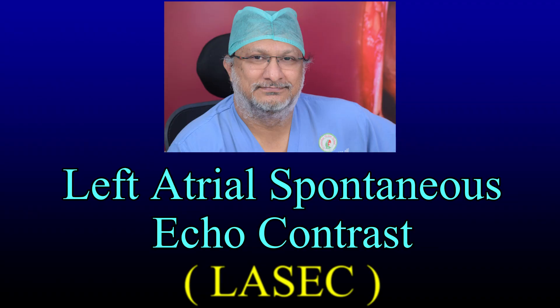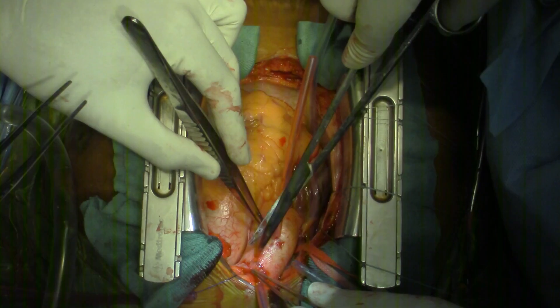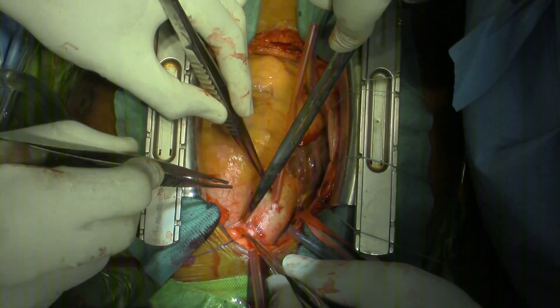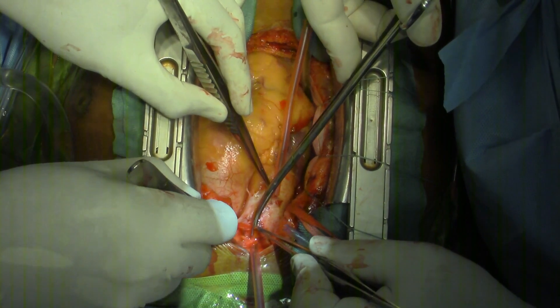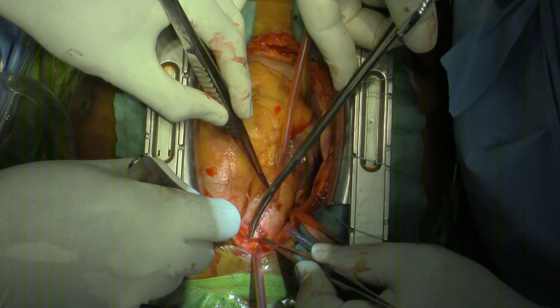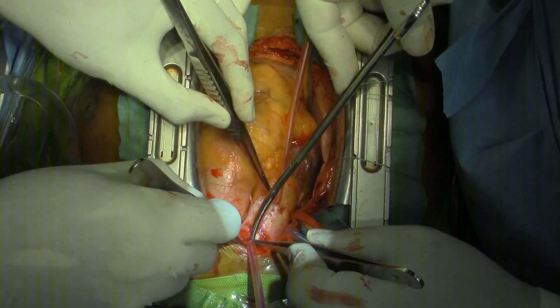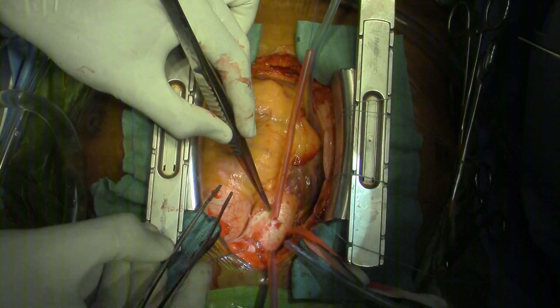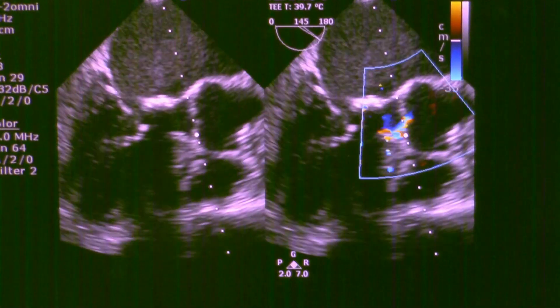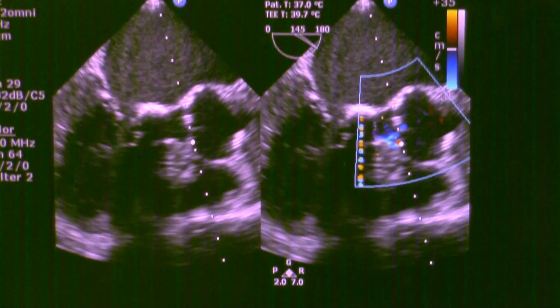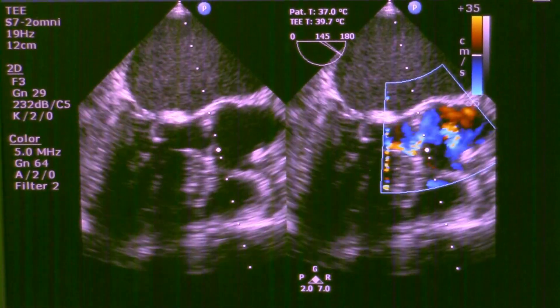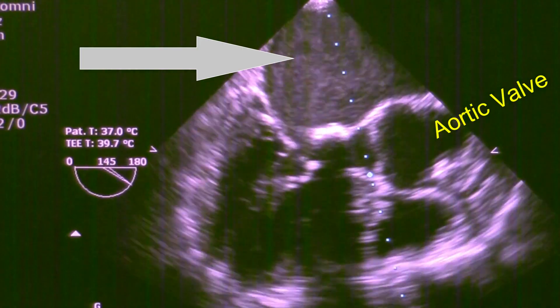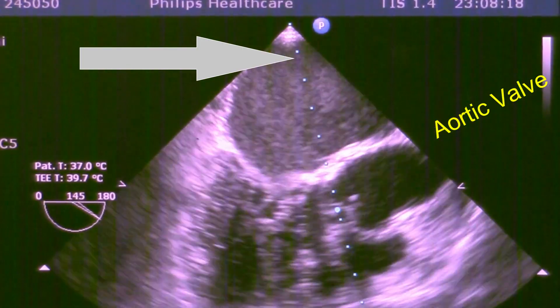This video is about left atrial spontaneous echo contrast seen in patients with severe mitral stenosis and atrial fibrillation. This is a case of severe mitral stenosis, borderline aortic valve disease, and severe pulmonary artery hypertension, undergoing mitral valve replacement. On transesophageal echo, you will see swirling of blood within the left atrium.